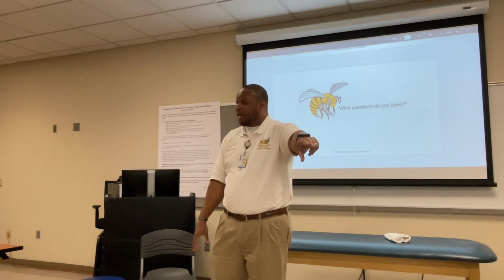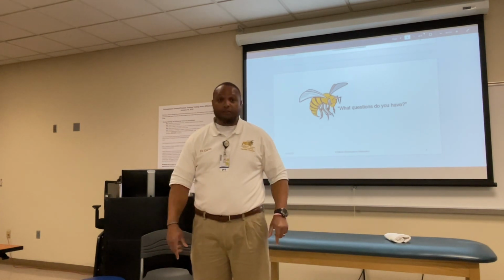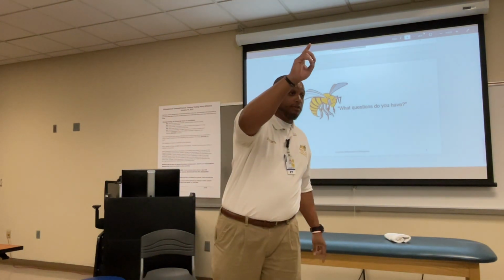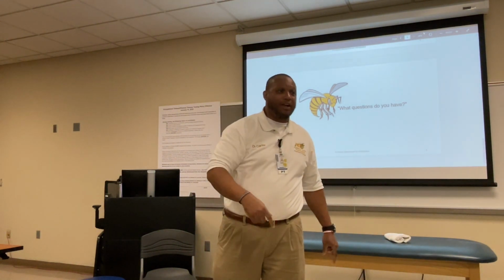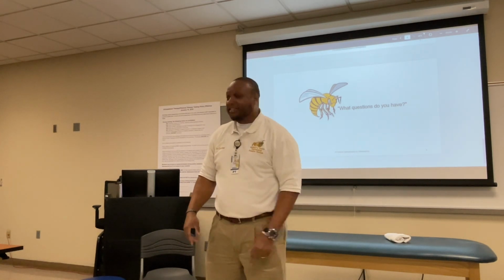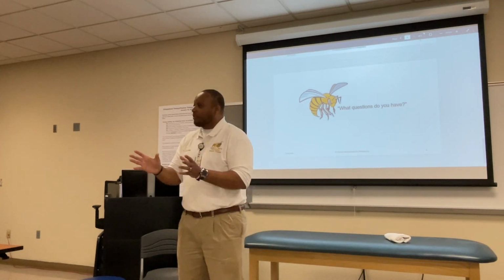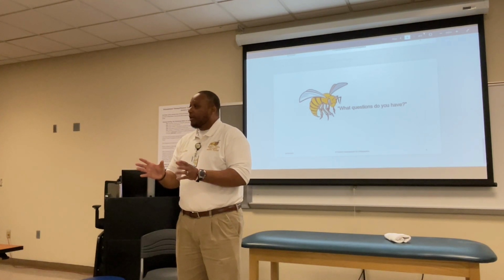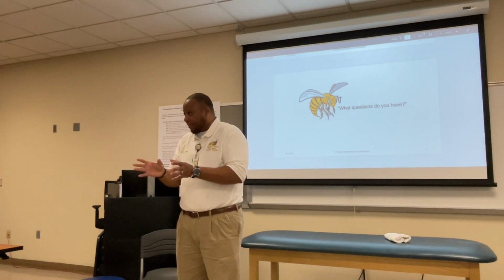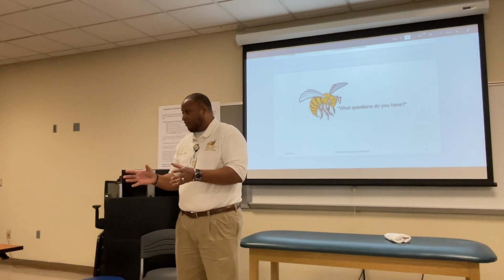So if Acacia takes knee flexion, Tabian takes knee flexion, Zai takes knee flexion, Kiki takes knee flexion, if all y'all take someone's knee flexion range of motion, it should be within at least a 5 to 10 degree difference according to Norkin and White for inter-rater reliability.